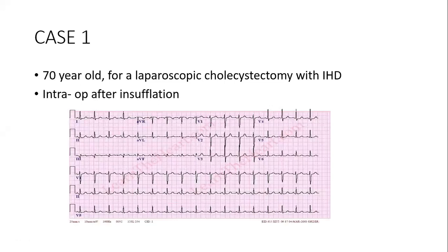Okay, our first case. We are all anesthetists here in this session. Before I continue. Yes, Doc. Okay, I'll take that as a yes. All right. Our first case, you are going to anesthetize an old patient for an elective surgery.